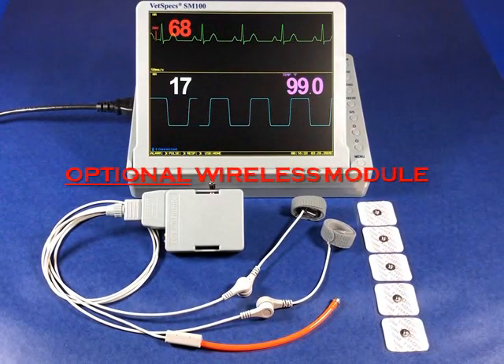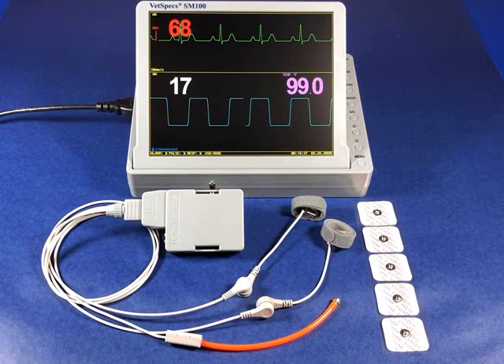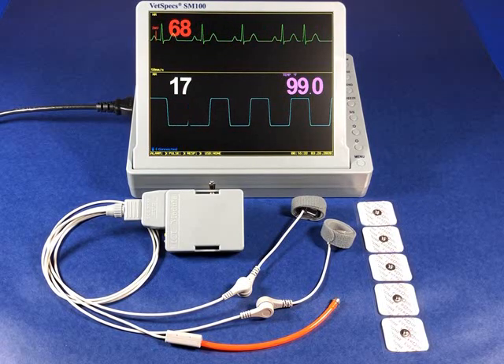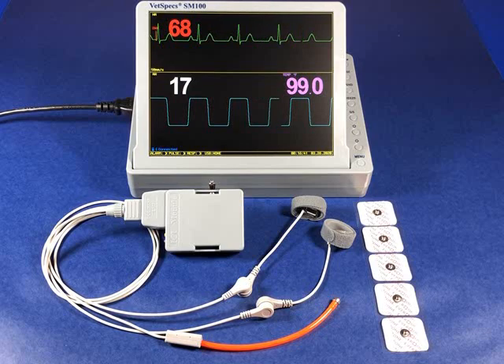The SM100 now offers an optional wireless monitoring package, which is an ideal add-on for making use of the system in times it would typically be idle. Suggested applications for the package include intensive care, post-op and pain management, plus ECG screening, each of which offer the potential for supplemental revenue generation.